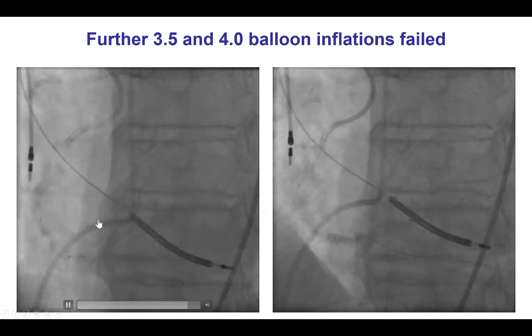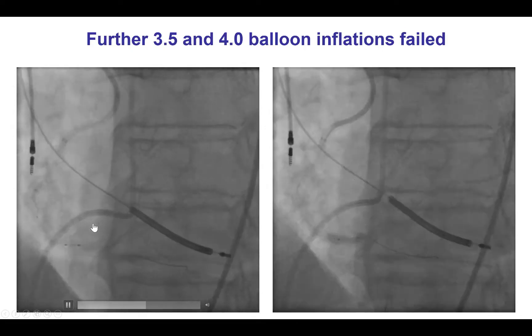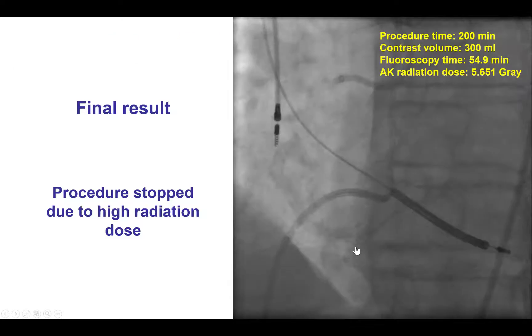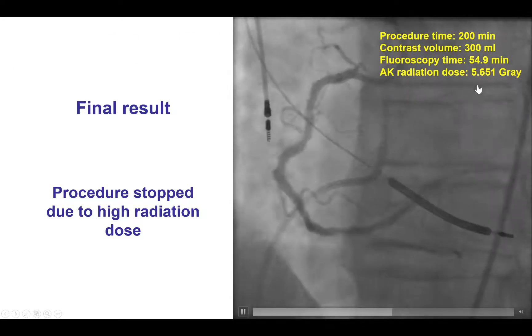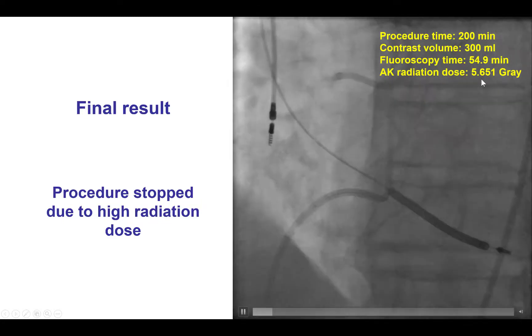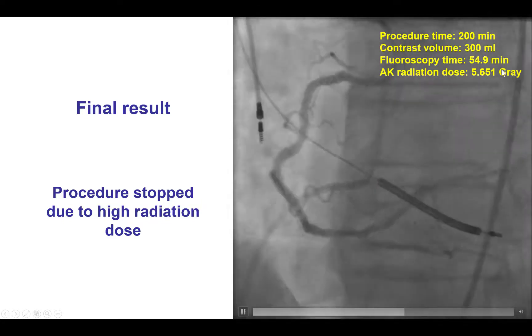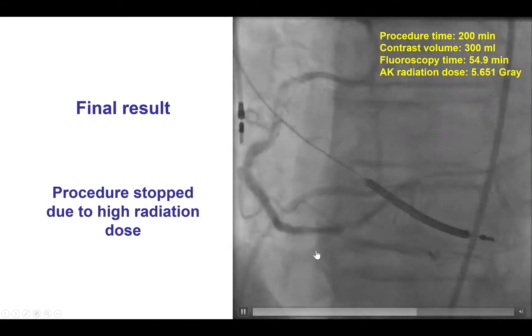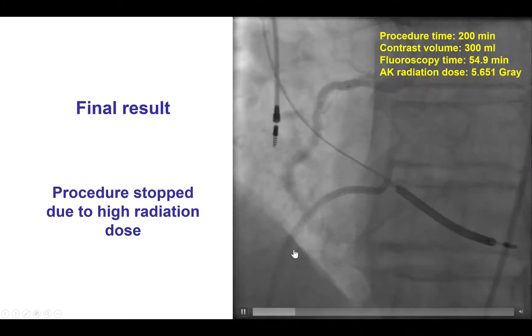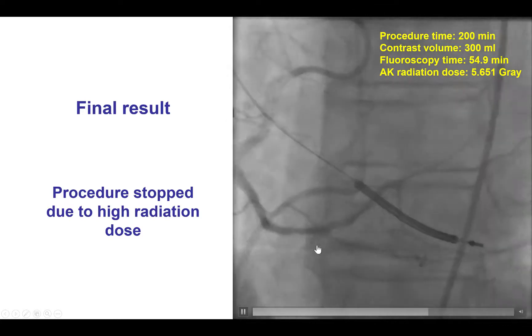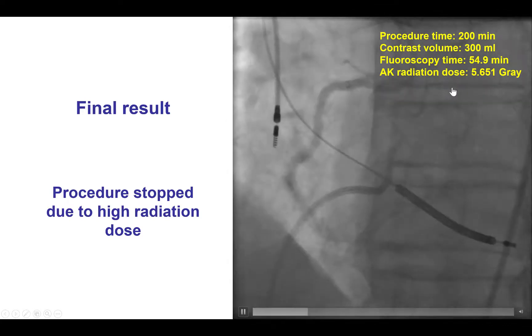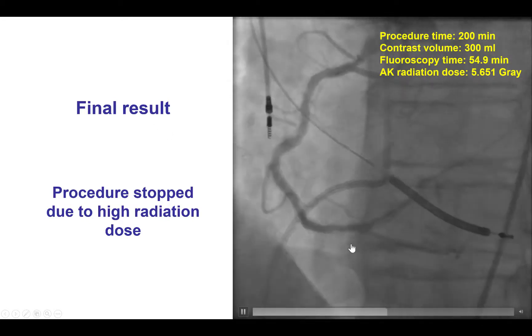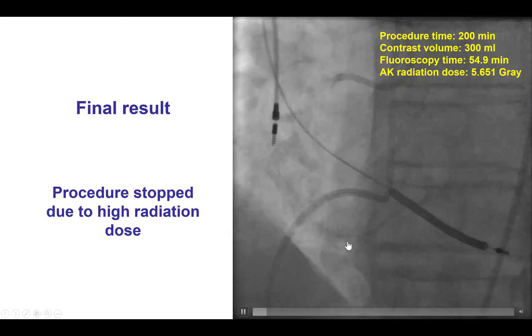The good news was that at least the equipment was removed. We did some additional attempts to dilate the lesion with high-pressure balloon inflations. But at this point, we had reached 5.6 gray of radiation and had been in the lab for more than three hours. The patient did have TIMI 3 flow in the distal vessel. Although we could have done things like laser with or without contrast, we decided to stop the procedure at this point for safety reasons — to prevent radiation skin injury — and potentially bring the patient back for a repeat attempt in the future.